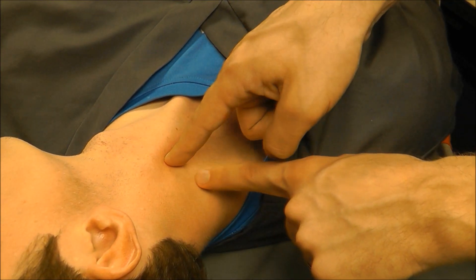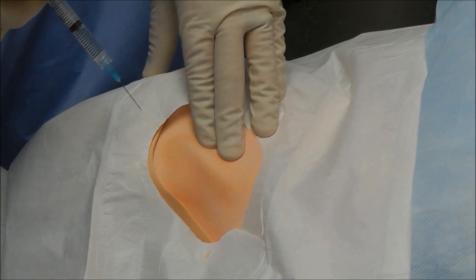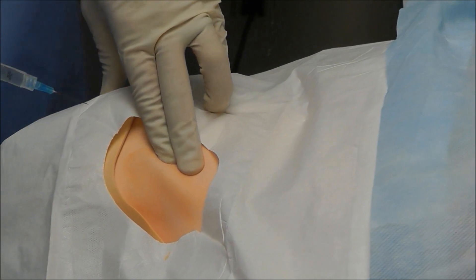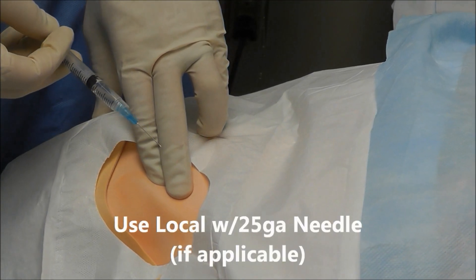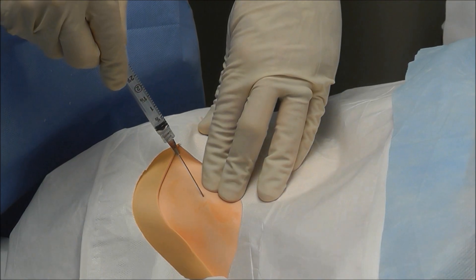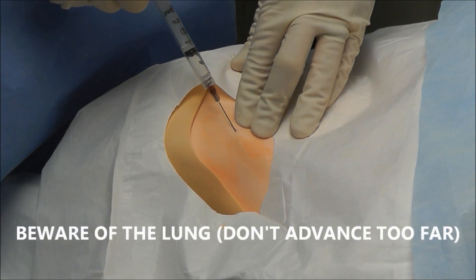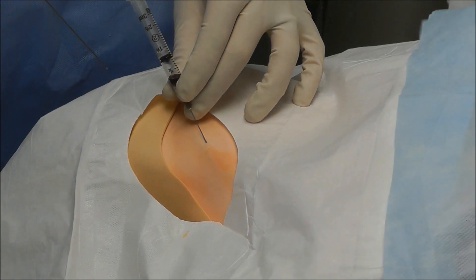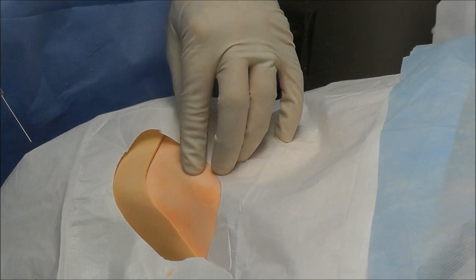Once we insert our needle at this point, we use it at a 45 degree angle and point it towards the ipsilateral nipple. Now that we're at the appropriate landmarks — lateral to the carotid pulse, about the level of the thyroid cartilage at the apex of the sternocleidomastoid — it's time to localize with a 25 gauge needle if the patient is awake. After that's done, it's time to use our finder needle. Right when you get under the skin, you hold negative pressure, and when you enter the vein you should get a flash of blood. It looks like I've hit it right there. Sometimes after you hit the vein with the finder needle, you can hold it there and grab your other needle and directly find it, or simply take it out and remember where you inserted.